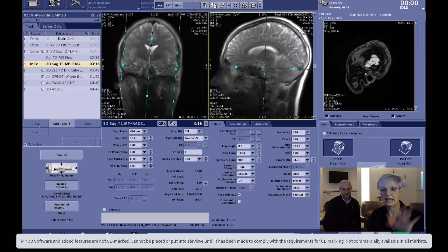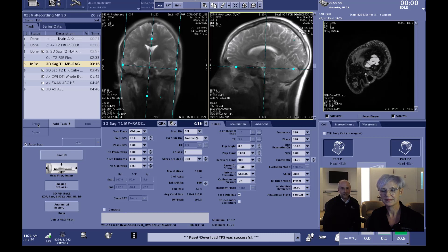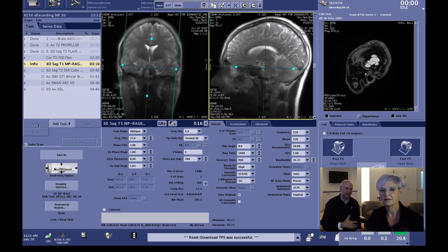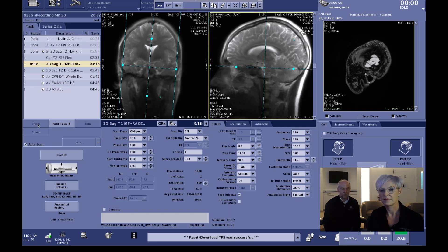Hi everyone, my name is Steve Lawson. My name is Anya Pofana. We are here in our bay at Waukesha, Wisconsin on the SIGNA Architect scanning on our MR30 software. This particular software, as you may have seen on the previous video, expands out some of the features of Air Recon DL and allows us to use that in 3D and propeller imaging, but we've also expanded it out into some other applications as well. We'd like to share some of that information with you.